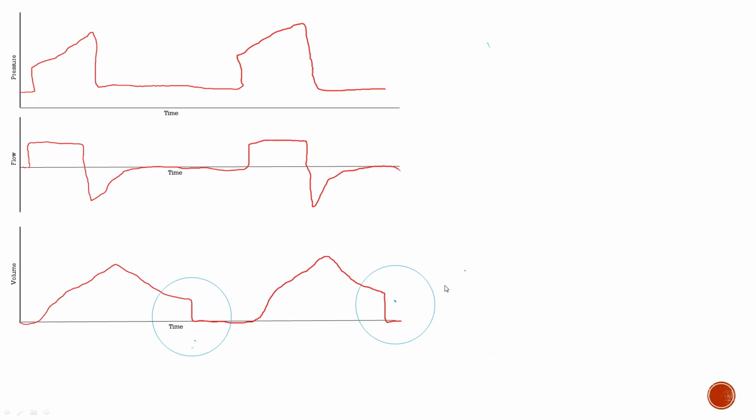It's a lot easier to pick up on the volume scalar than looking at the VTI and the VTE, subtracting every breath and hoping you catch it at the right time. You can visually pick it up right here really quickly, and you can also estimate it and watch it go down when you inflate the balloon or fix the leak problem or put in the chest tube. Or if you have a patient with a trach, you can set them up and see if the leak goes away. You can just watch this, and it's a lot easier than counting numbers and calculating percentages.